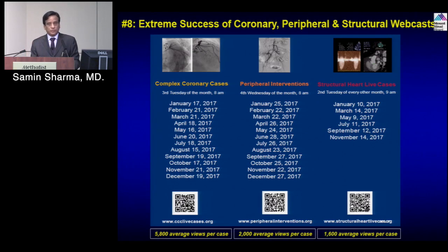Why do I say that for sure? The reason is, even in the ROTAXUS trial, they had a better lumen gain acutely. So the lumen was better with rotational atherectomy and stent versus PTCA and stent. But then you paid a higher price. What is the reason for the higher price? It's some kind of barotrauma. Now, what is the barotrauma with rotational atherectomy? It is very small. So it has to be that the heat generation has created more barotrauma or intimal hyperplasia, which translates into a higher restenosis.